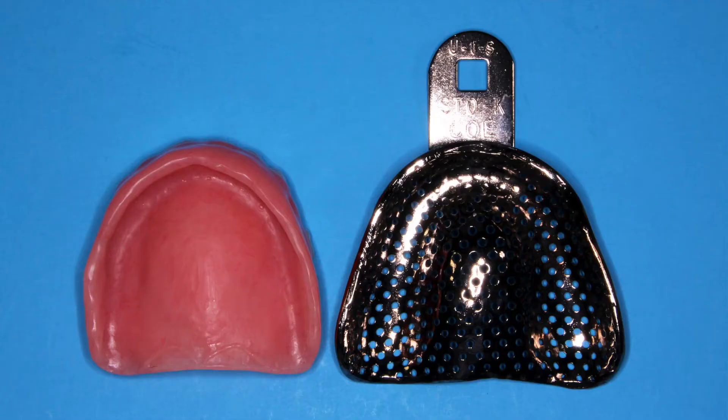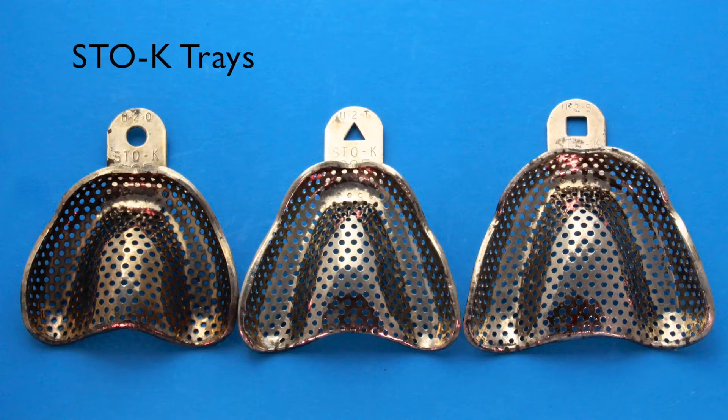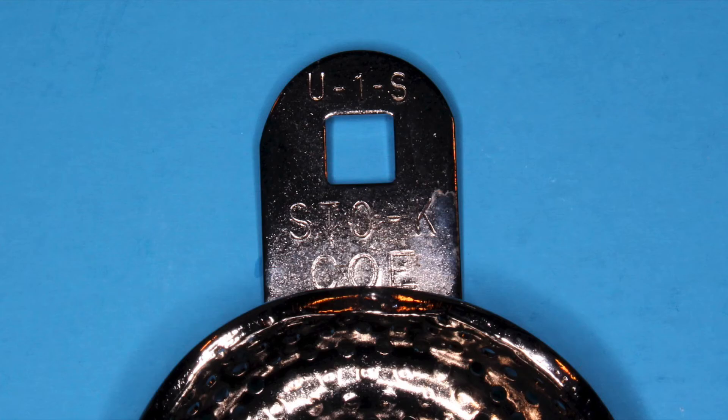Pick an edentulous tray that matches the size and shape of the arch. Stock trays come in three different shapes: ovoid, tapering, and square. Each tray has a hole in the handle that represents the shape of the tray. The number, for example U-1-S, stands for Upper Size 1 Square.